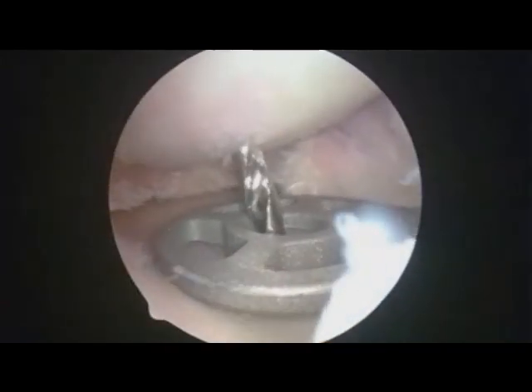So what we do is we put our implant, we make sure that we can sit it properly on the bone so it sits flush, and then through our hole what we're going to do is insert a drill. So this is just like doing an ACL reconstruction, and a drill will go up through the hole into the center of the device. Just to plug the water a little bit so they can see. Okay, so now our drill's been drilled.